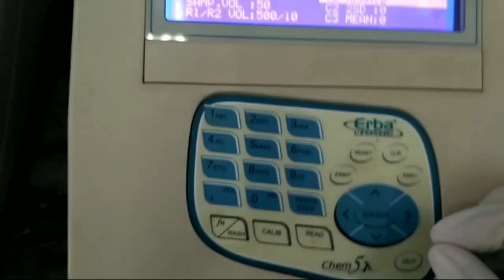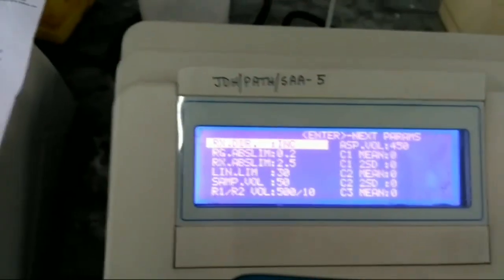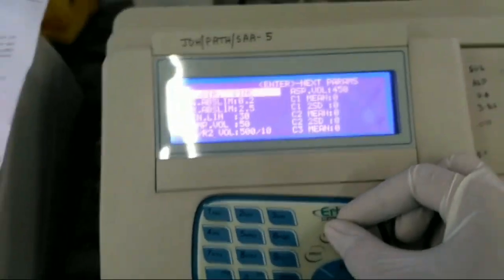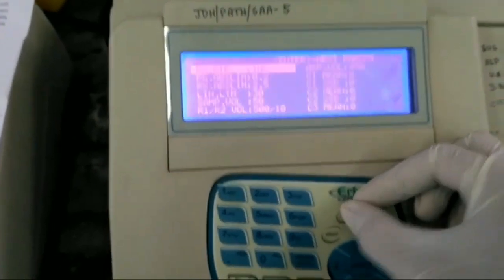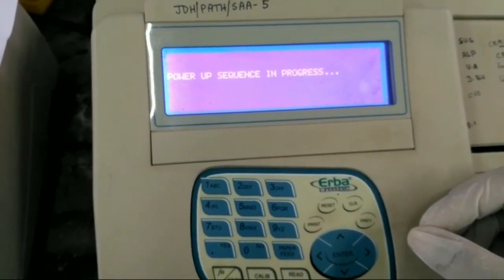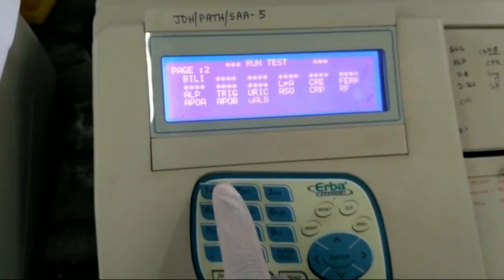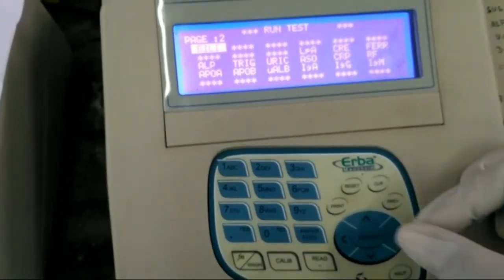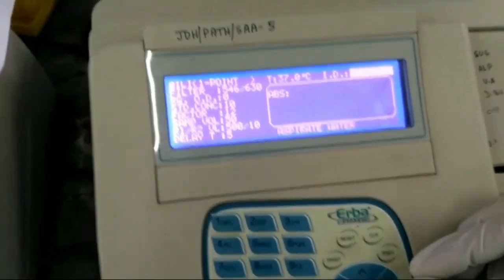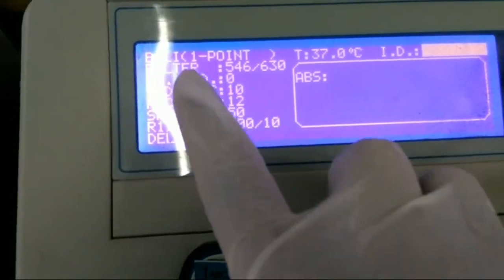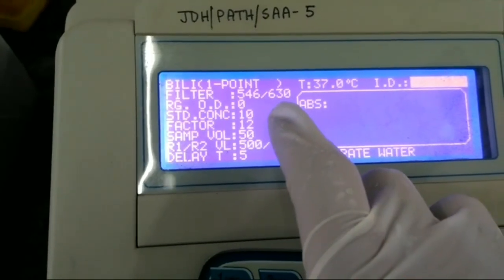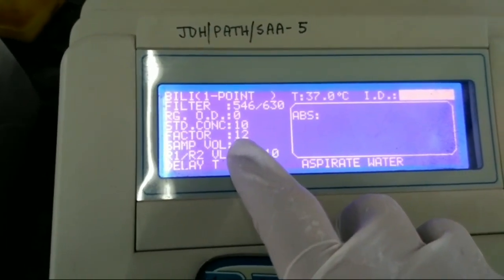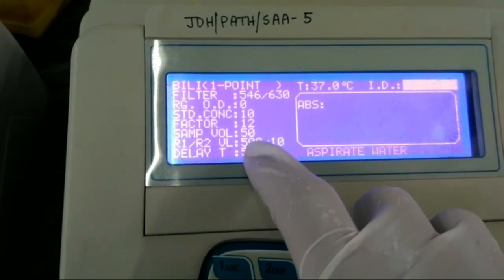After completing the program, we have to save it by pressing the FX switch. After saving the program, we have to reset. Press the reset switch, then press one for test. The program — bilirubin — is ready. We can enter and check: primary filter is 546, secondary is 630, standard concentration is 10, factor is 12, and OD will be generated automatically. The delay time is 5.